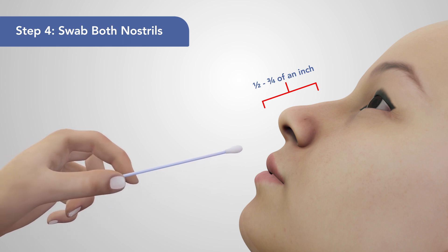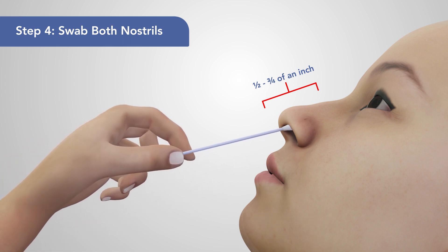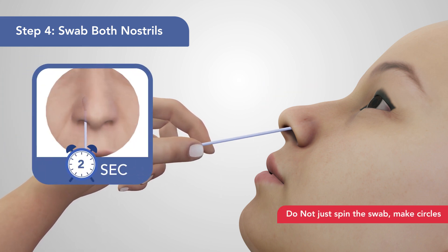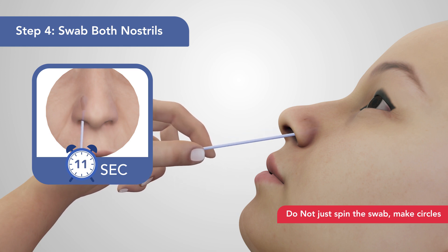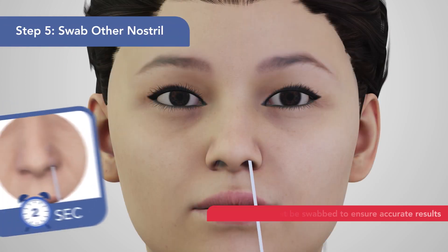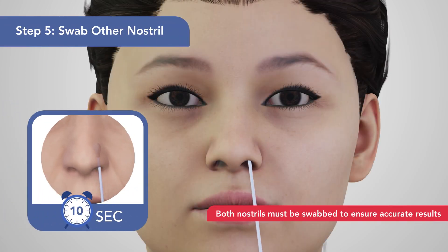4. Gently insert the swab tip into one nostril, roughly one-half to three-quarters of an inch. Using medium pressure, slowly rub the swab tip against the inside wall of one nostril and make at least five large circles. 5. Using the same swab, repeat step 4 in the other nostril.